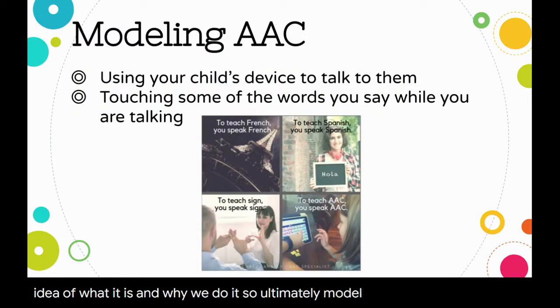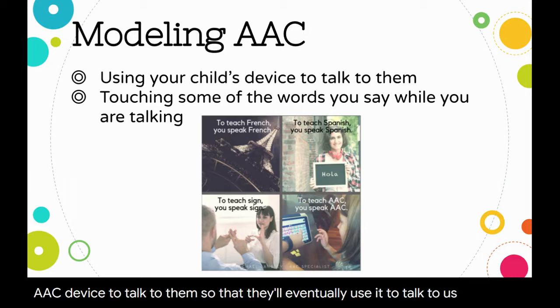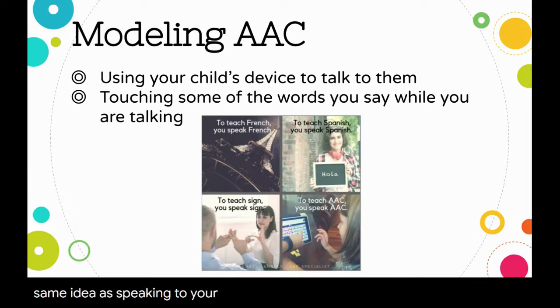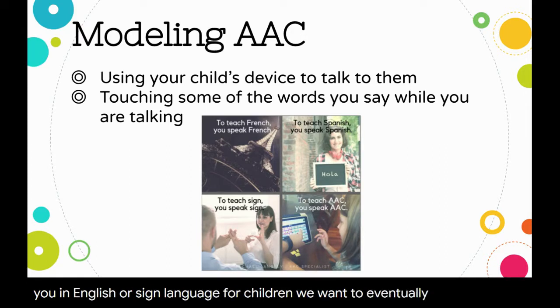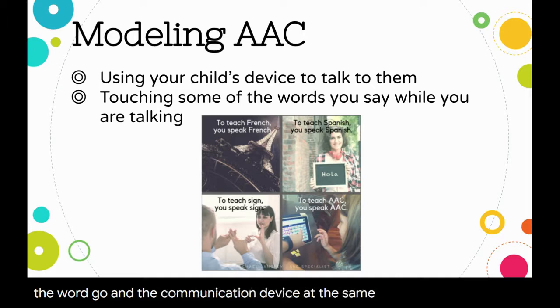Ultimately, modeling is using your child's AAC device to talk to them so that they'll eventually use it to talk to us. This is the same idea as speaking to your child in English to have them eventually speak to you in English, or sign language for children we want to eventually communicate through sign language. For example, if you were to say, "We're going to the grocery store today," you're going to say that phrase, and then you're also going to press the word "go" on the communication device at the same time.